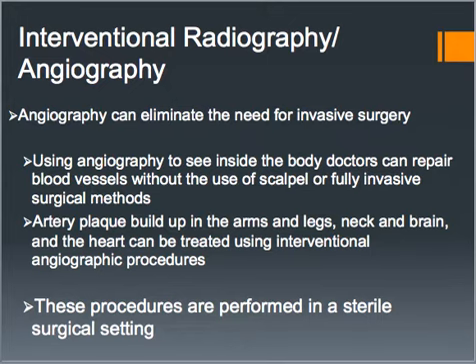Angiography is still performed in a sterile setting, and a lot of times it's actually performed in operating rooms or dedicated suites. So it is done under a sterile setting, which means free of all microorganisms. So a lot of times it's just easier to do them in the OR. Depending on the hospital and what the setup is, a lot of interventional radiology suites have dedicated units that are very large. The x-ray machines are very large, so they usually have a room set up that's dedicated just for them. Or, there are other procedures that they'll allow to be done in there, but it just depends on the facility or site that you're at.